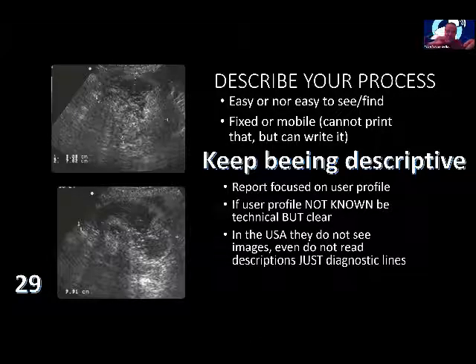So the physician who's going to solve or direct the patient to the solution of the problem knows the difficulties that can be encountered for a second opinion, or even for the surgery if needed. So try to be descriptive on everything, not just the image, but what happened.